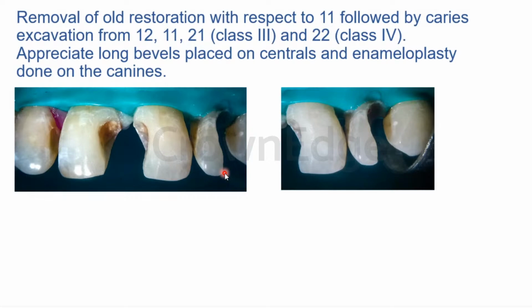In this case, we are doing a total etch of the enamel and dentine using 37% phosphoric acid gel. You can wait for approximately 15 seconds to 20 seconds. Remember, guys, over etching is bad. That is another answer I want from you guys. All the theoretical answers I'm going to be asking you. All right. So, what is over etching? What does over etching do to the enamel and dentine? How is it going to affect our final bond strength, right?